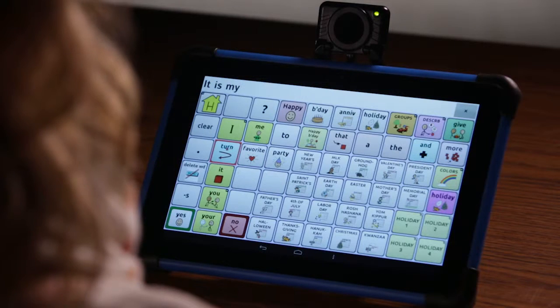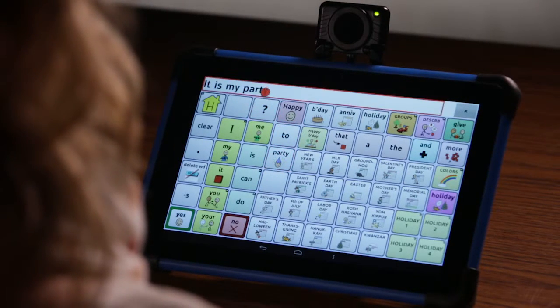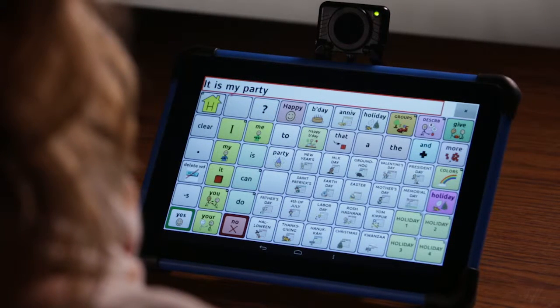If Use button as rest area is turned on, the rest area size setting will not adjust the size of the rest area within the chat software vocabulary pages. It will only adjust the size of the rest area within the operating system.